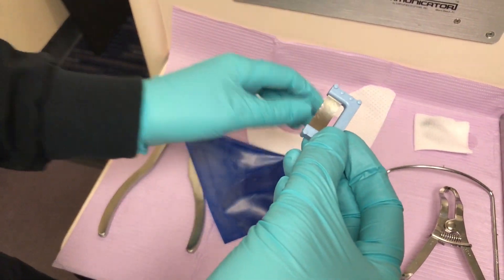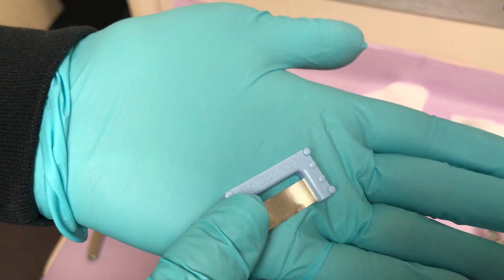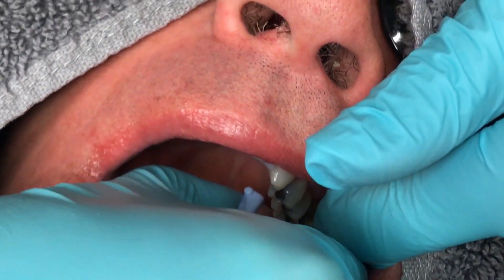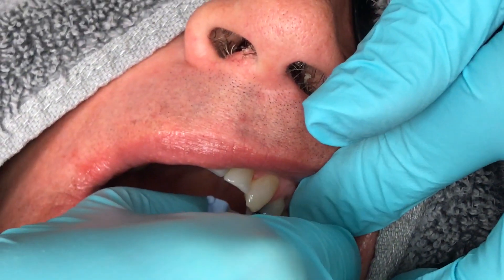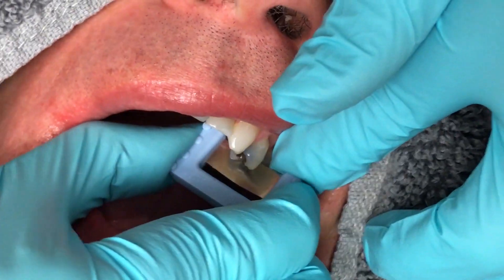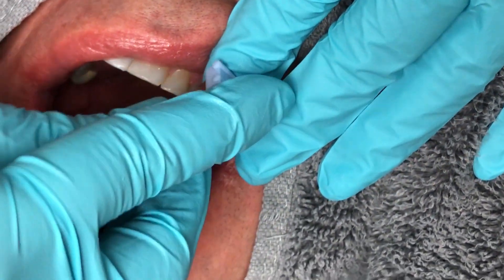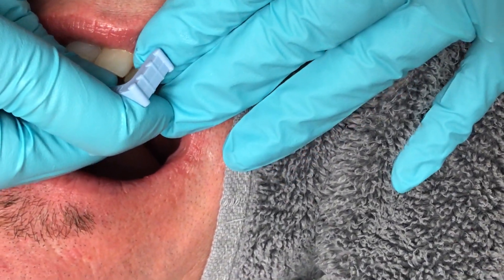A very important step needs to be completed before the dam is placed. Using the blue True Contact Saw, each contact is groomed to optimize it before flossing the dam between the contacts. Being careful not to cut the patient's gum, I run the True Contact Saw through each contact. It is also a nice gauge to help know how tight each contact is, identifies any ragged or rough contacts from previous restorations, and removes any debris from between the teeth.